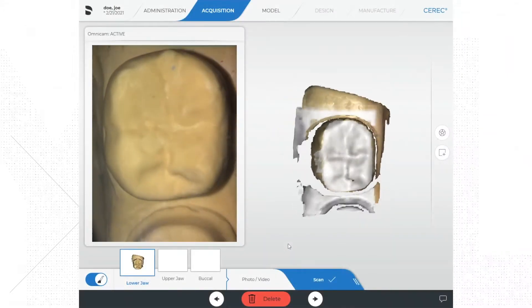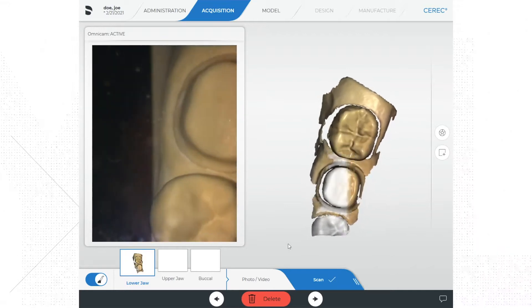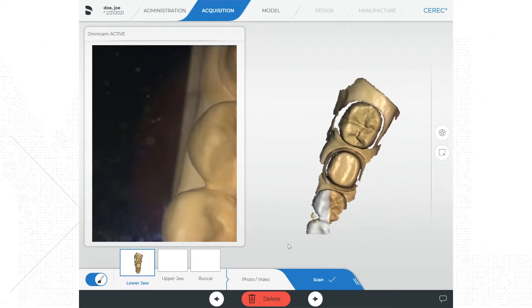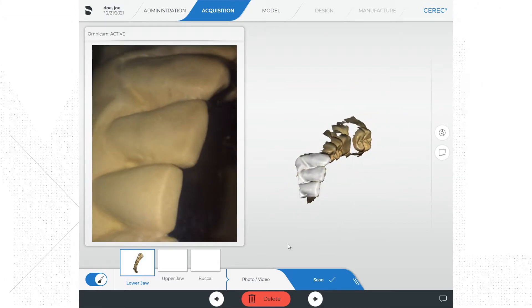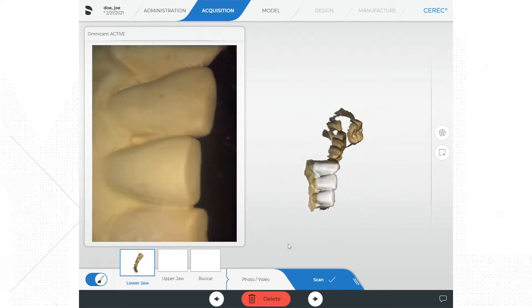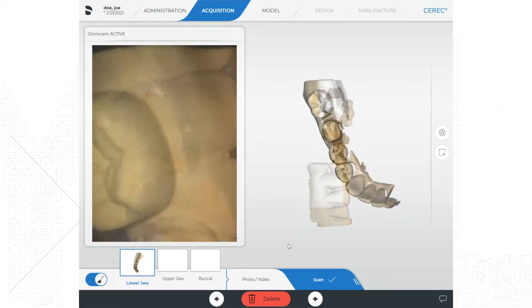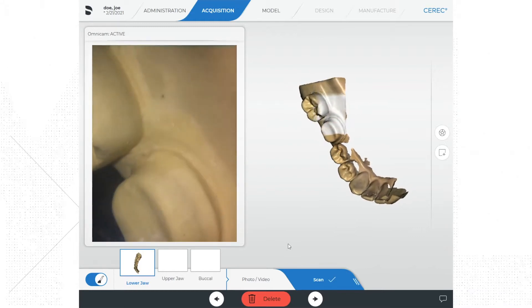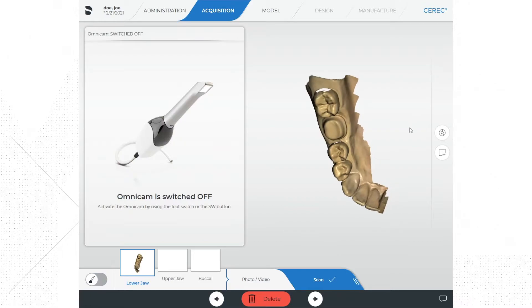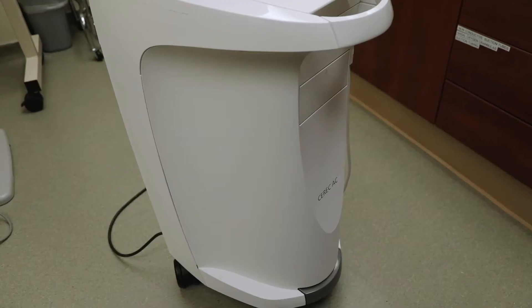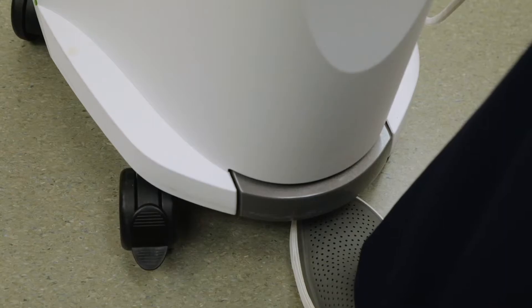Personally I prefer to start the scan on the occlusal surface at the most distal tooth in the arch. I then scan the occlusal surfaces of the quadrant up to the midline, then rotate to the facial surfaces and go from the front to the back. At the back of the mouth I rotate to the lingual and proceed to scan from back to front. I then check my scans and look for any areas that need to be re-scanned.